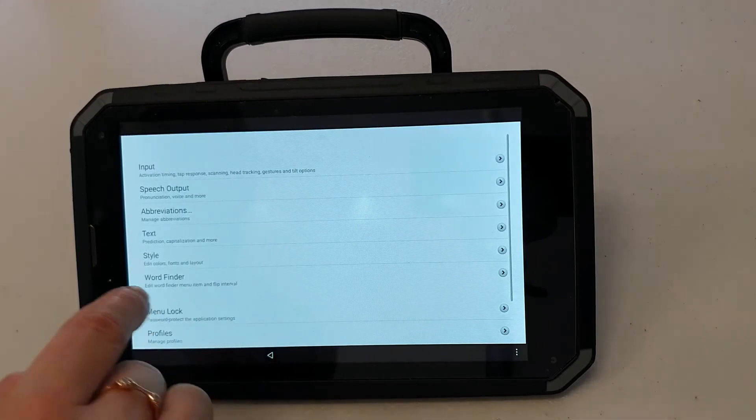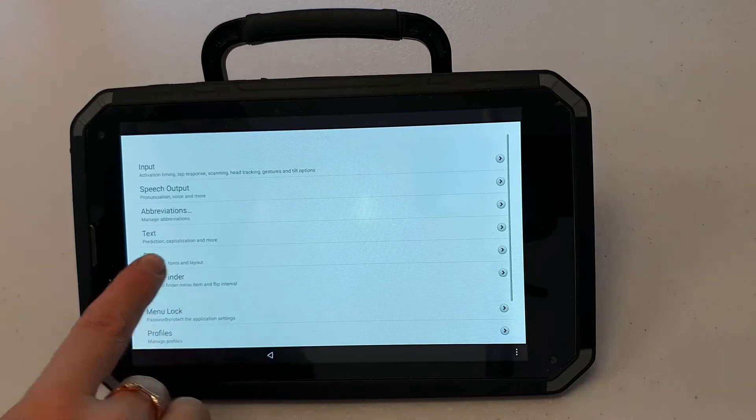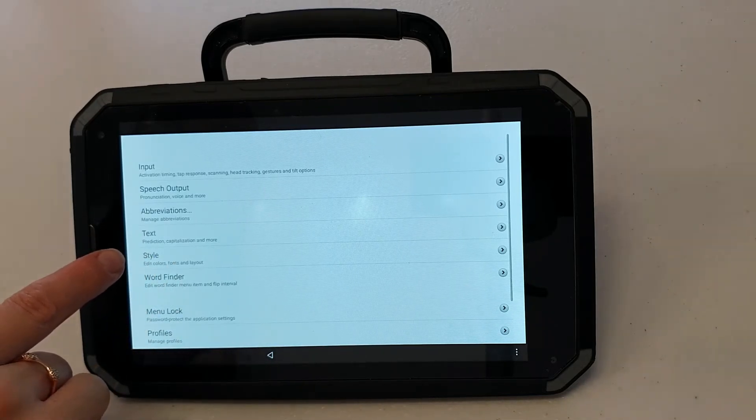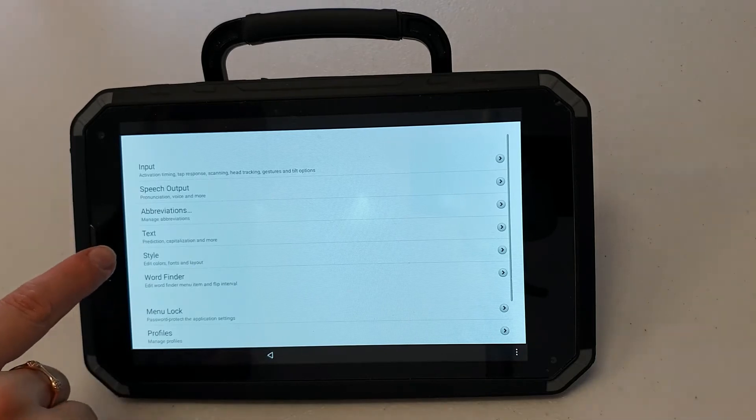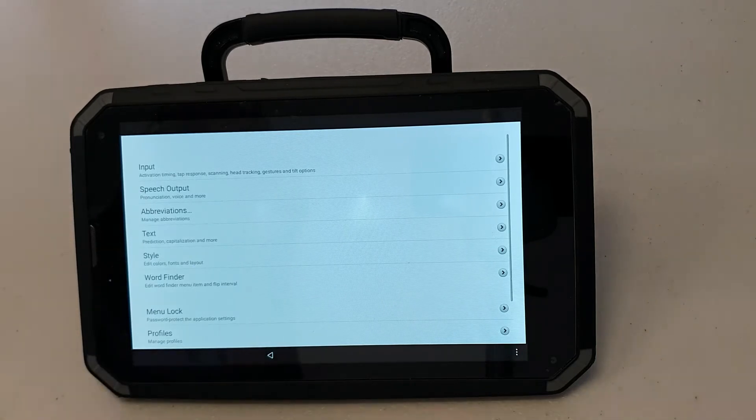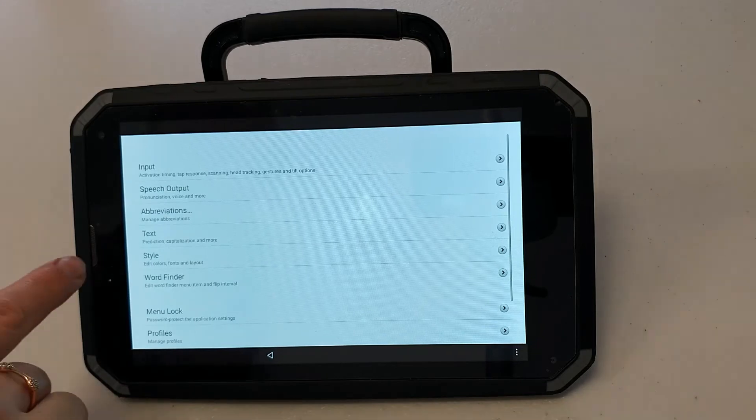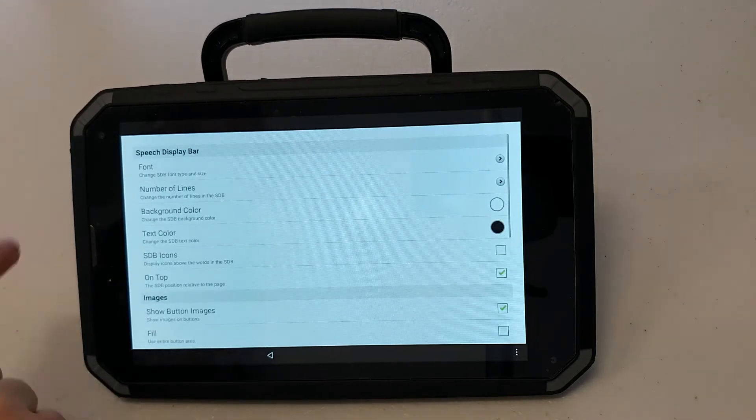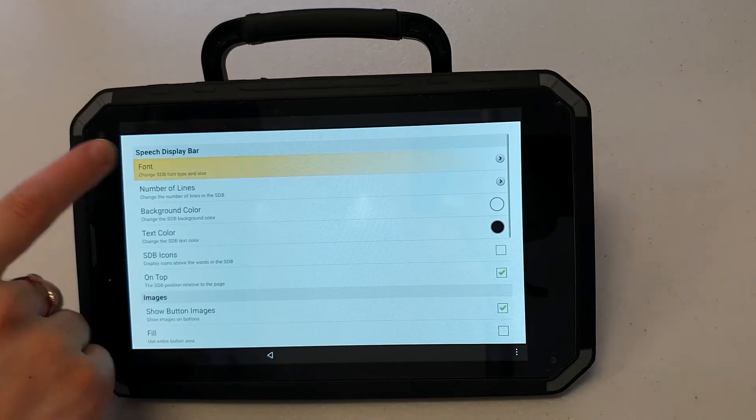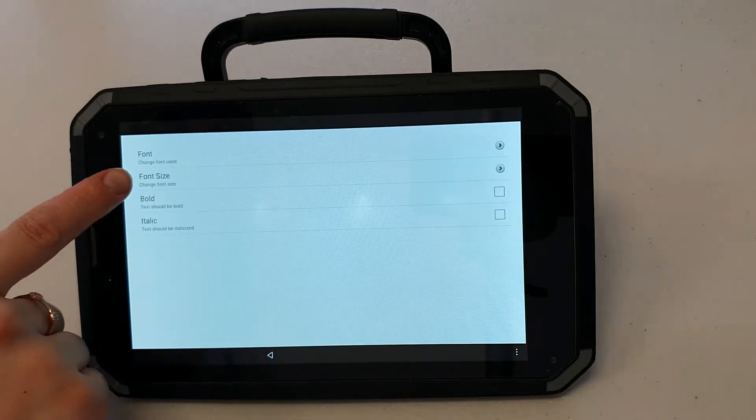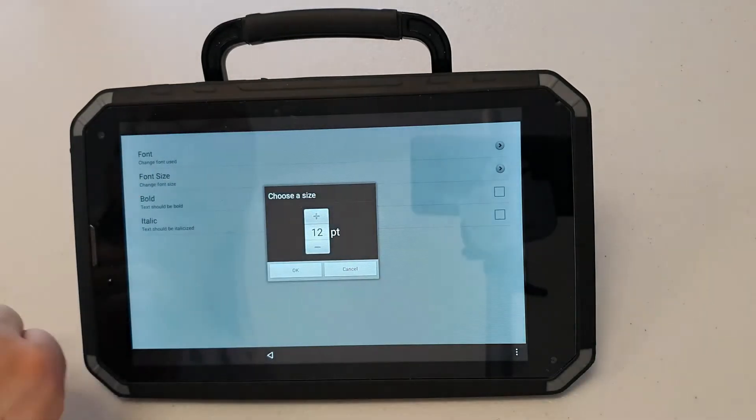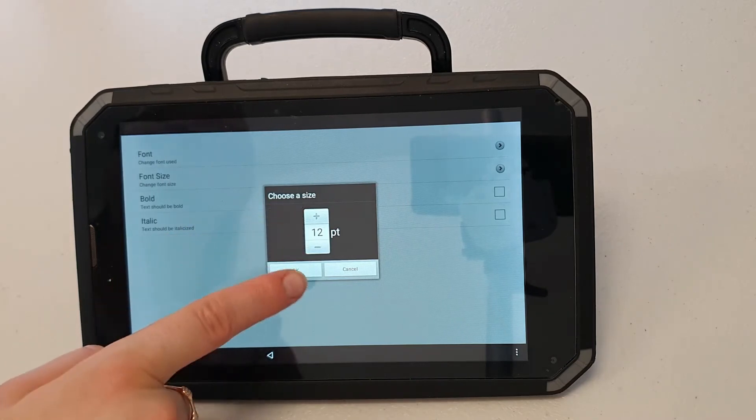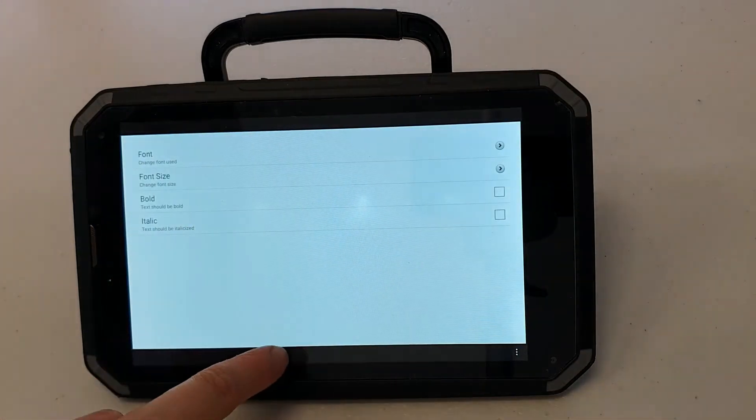The other setting that I might consider changing is the size of the text that appears in my speech display bar. This might be important for people who require larger text in order to read. I can go to style, font, font size and I can increase it using the plus sign here.